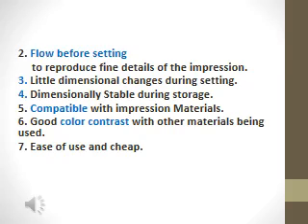And this is also important during storage. After setting or hardening of the model and before using it, sometimes you have to wait before using the die or the model. So during this storage time, the model should not exhibit any dimensional changes. It should be dimensionally stable in order to preserve its accuracy, its accurate surface.